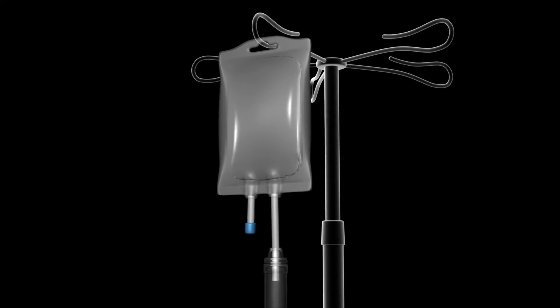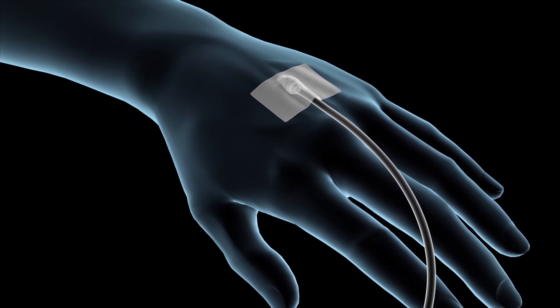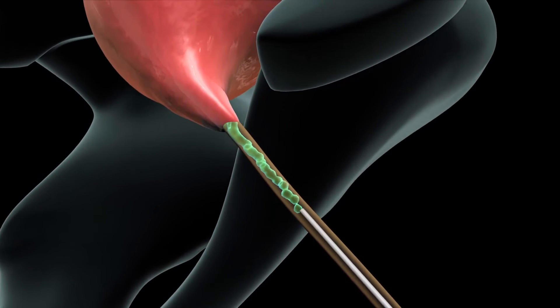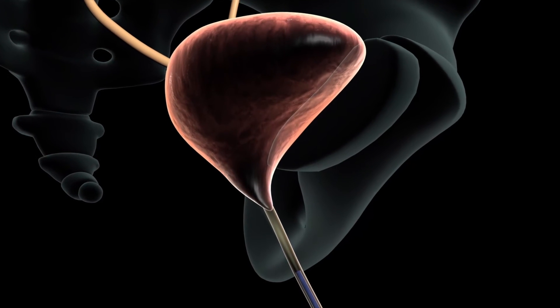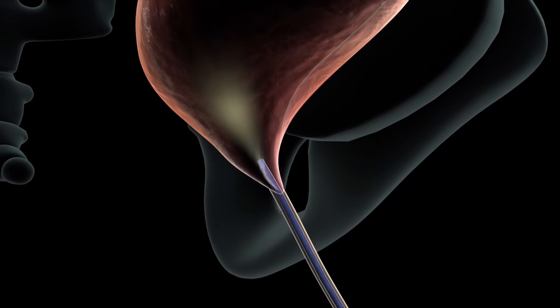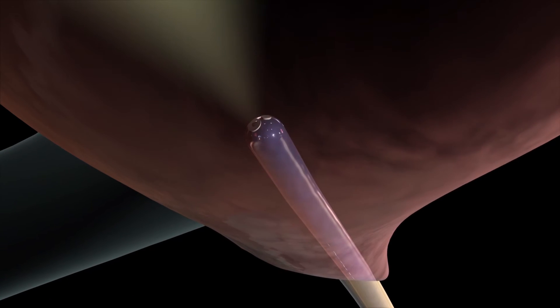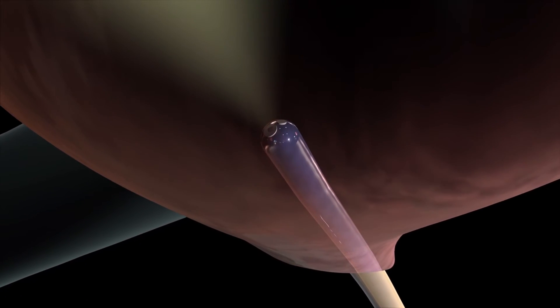Before your procedure, an IV line may be inserted into your vein to provide medication. Your doctor will begin by applying a local anaesthetic to numb the area. Once the area is numbed, he or she will gently insert the tip of a cystoscope into the urethra and slowly advance it up into the bladder. The end of the cystoscope contains a light source and lenses, which project images through an eyepiece and onto a video screen.